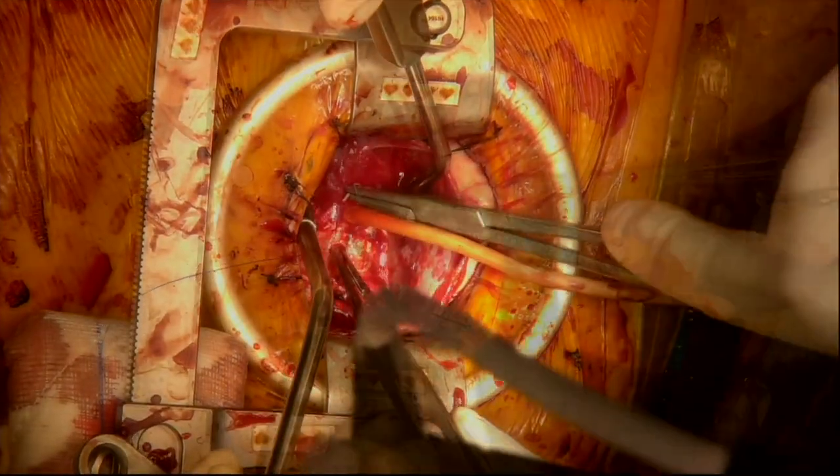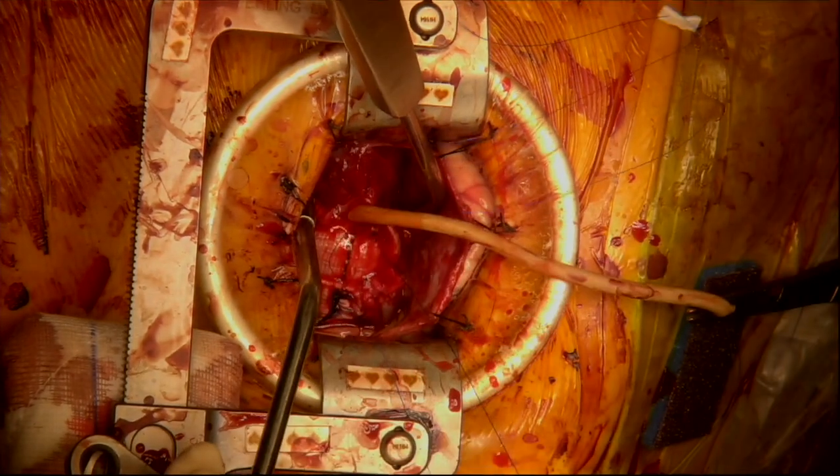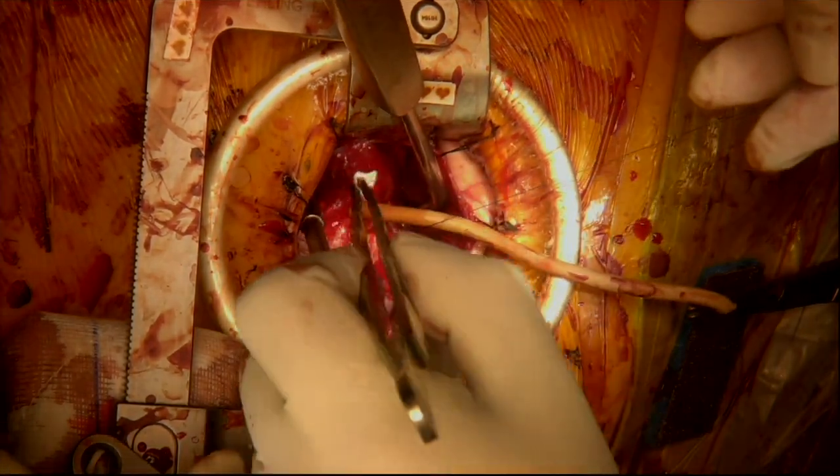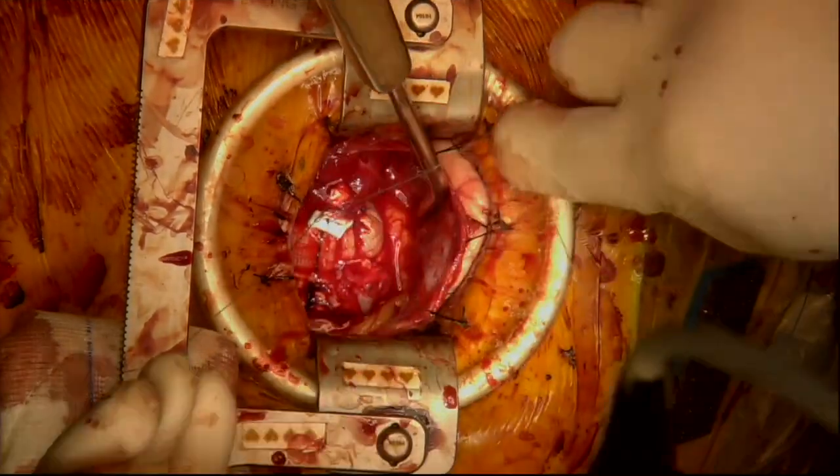The opening is then repaired with a double-pledgeted suture, and then the purse string is tied.